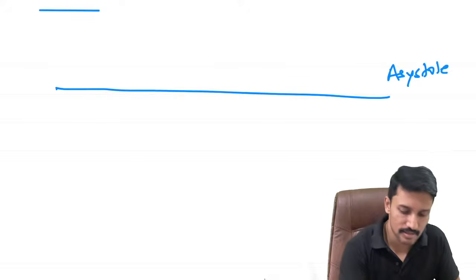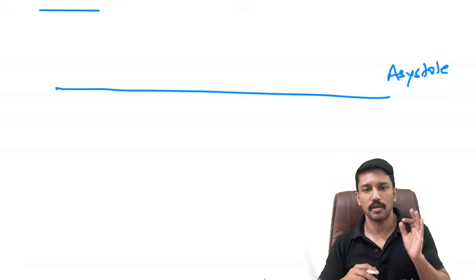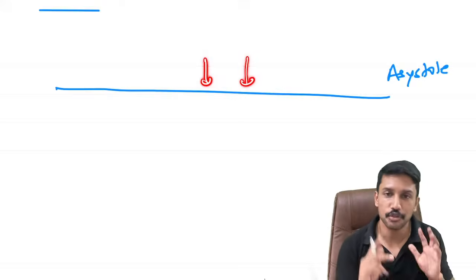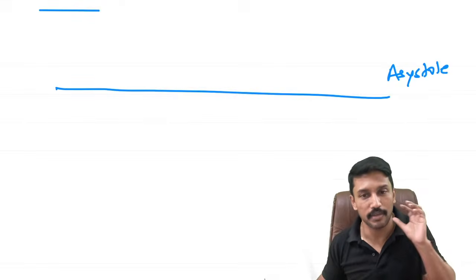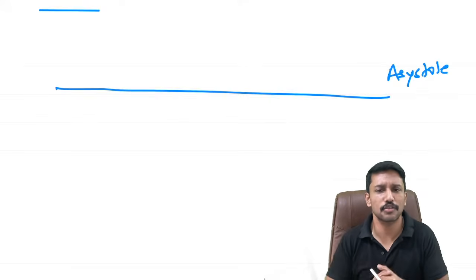So when someone gets this ECG picture, this is a non-shockable rhythm. We are not supposed to give shock because the heart is already stopped. By shocking him, I make sure that it stays stopped, right? Whatever little chances of recovery he had, I'm taking away by giving him shock. So then again, why are we giving shock?